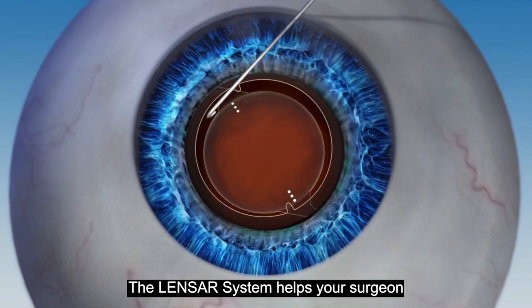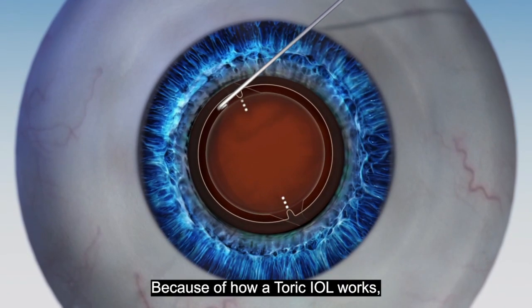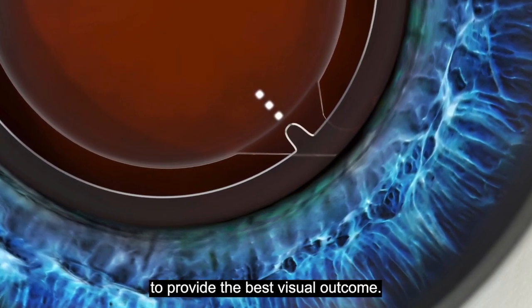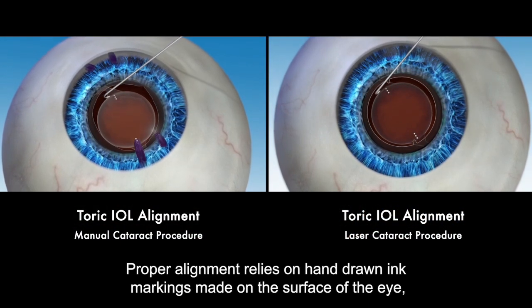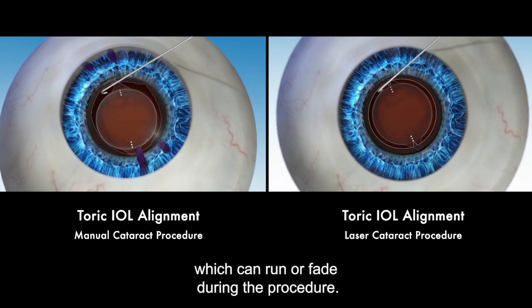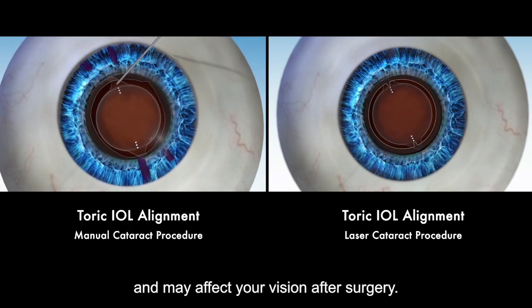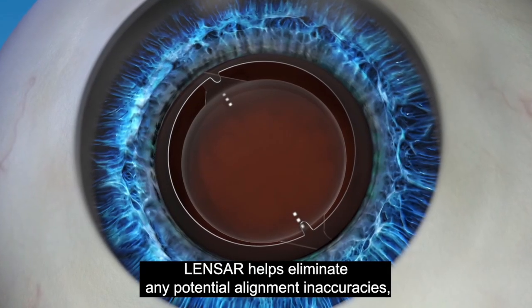Here in the femto laser, the capsular axis gives us 2 nice nubs or markings such that the alignment of the dots which are on the lens align perfectly with the axis that was planned for the patient. So the toric alignment in the manual technique is done by ink marks, and in this technique it is done much more sophisticatedly such that the placement is exactly to the T, and this helps in lesser specs number post-operatively.